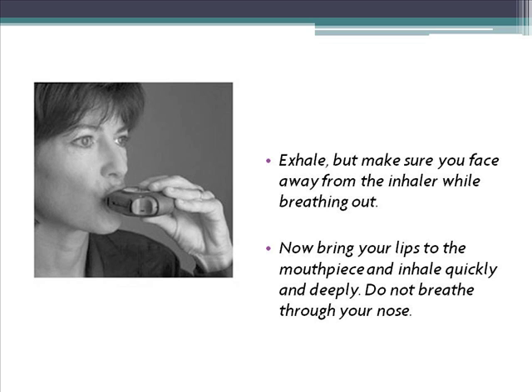3. Exhale, but make sure you face away from the inhaler while breathing out. 4. Now bring your lips to the mouthpiece and inhale quickly and deeply. Do not breathe through your nose.